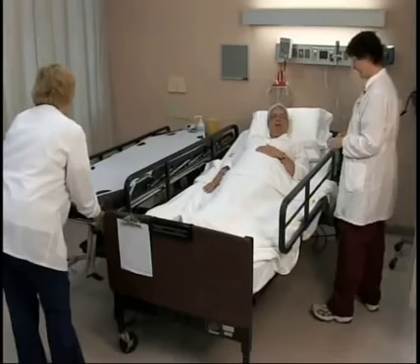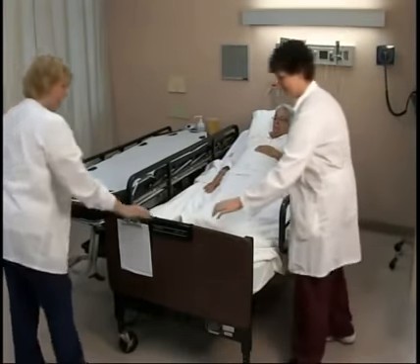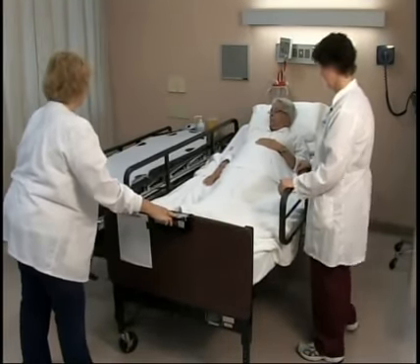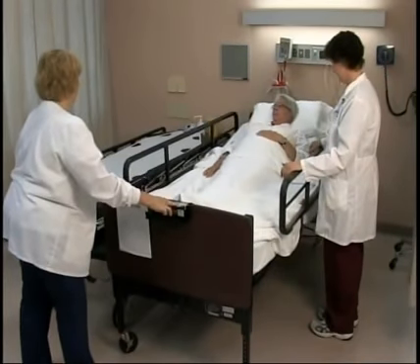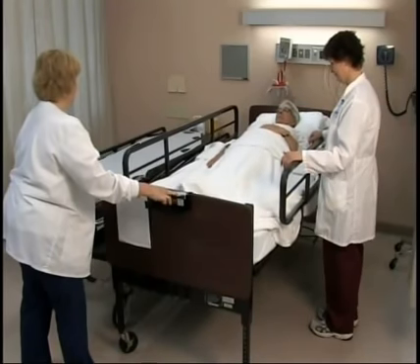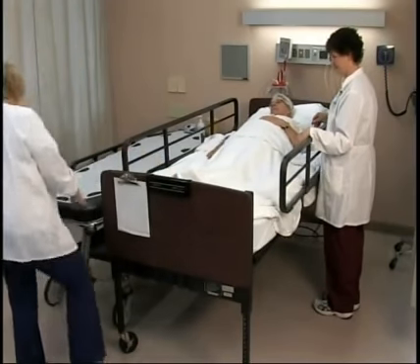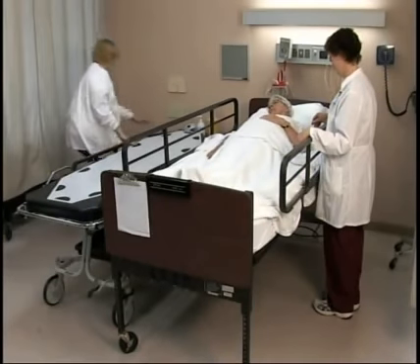Position the stretcher next to the bed with the head of the stretcher at the head of the bed, and adjust the height of the bed so the bed is slightly higher than the stretcher. Lock the wheels on the stretcher and lower the head of the bed even with the stretcher. Again, make sure that the stretcher wheels are locked.